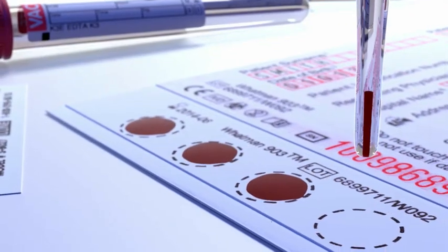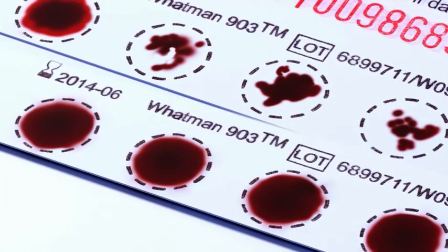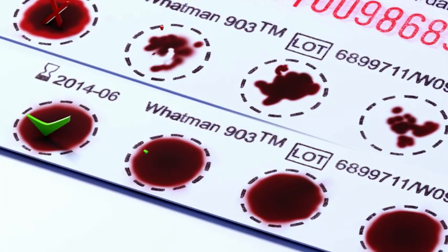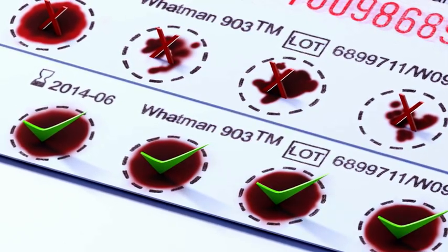Repeat the procedure for the three remaining circles of filter paper. Incorrect sample handling may lead to false positive results or sample rejection. Therefore, make sure the blood covers the whole of the circle.